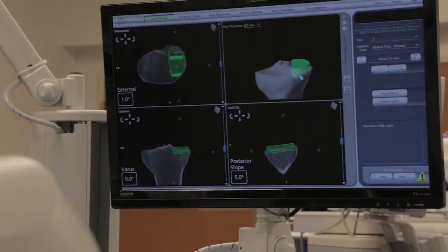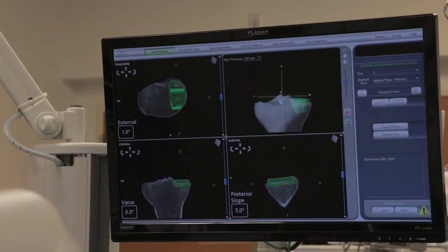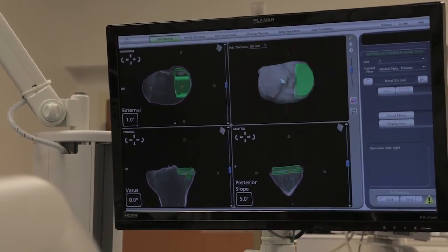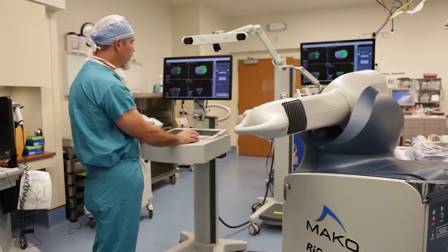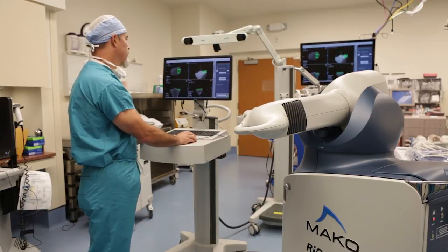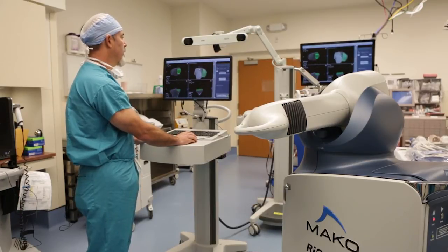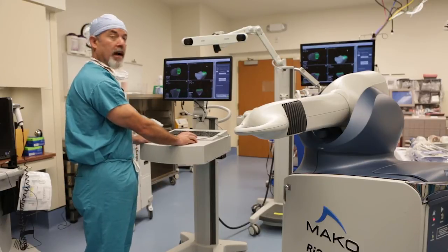The last thing I do on the tibial piece is look at the three-dimensional bone model, which I can spin around the X, Y, and Z axes. Typically I look at it from above, just like looking straight down on the shin bone, and I can see the component is well supported all the way around. Spinning it up from the front and looking from the bottom, I can see the keel and two post holes engaging good cancellous bone in the middle of the medial side of the tibial plateau.